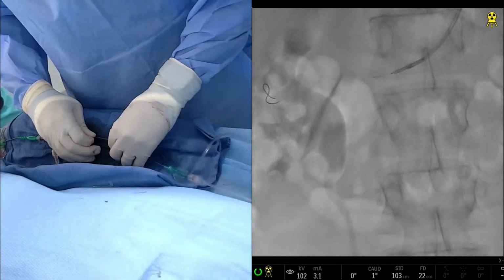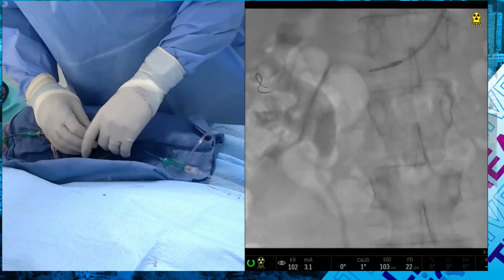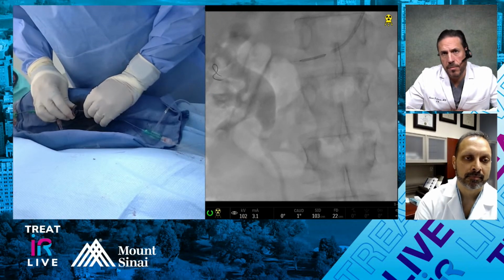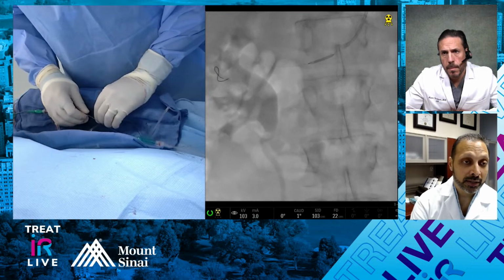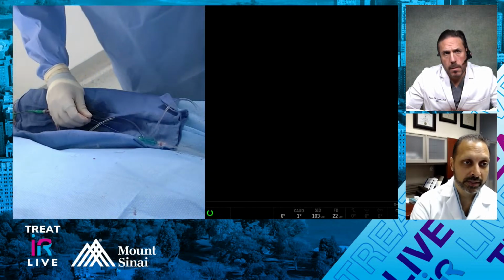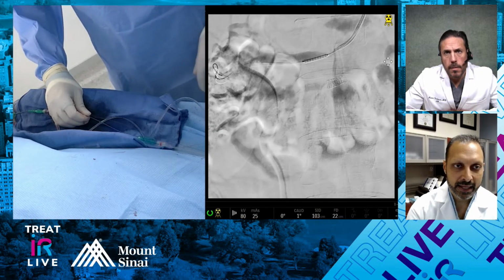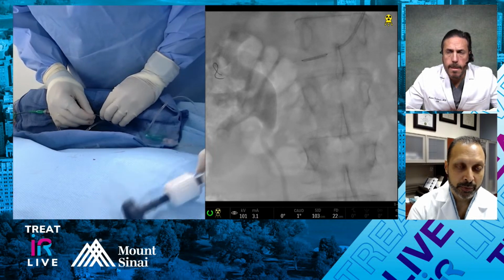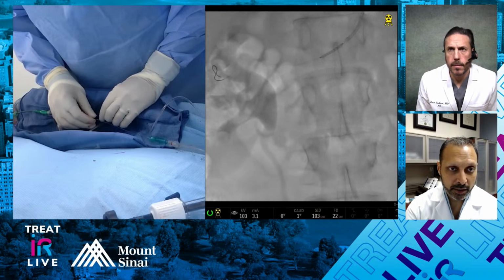Parag, is there anything that you would do differently in a setup like this if you were going to do femoral access? Would you be using the monorail system, or are you thinking about other potential stent platforms or wires? No, I think there are a lot of similarities with the setup here. It's the same platform as Rob had mentioned. I have not transitioned to 035 systems in renal intervention, so I do prefer an 014 setup. They tend to be monorail.